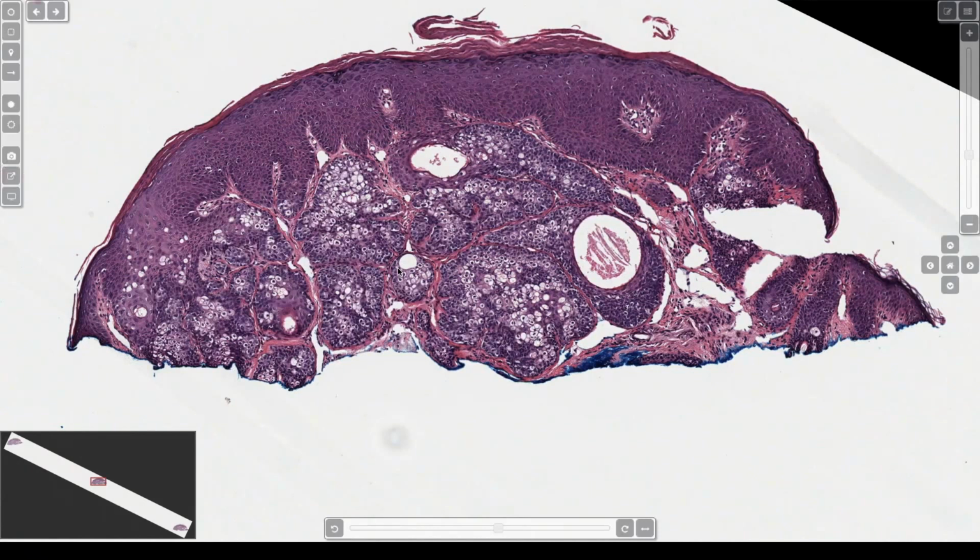And if I have one that's a little funny looking and it's shaved across the bottom and transected, sometimes I'll say, I think it's a sebaceous adenoma, but it's got some atypia. Please do an excision just so I can see the whole thing. Because I did have one once that I thought was sebaceous adenoma and it recurred and it was actually a carcinoma, but on a superficial shave didn't look atypical at all. So I don't routinely recommend these be re-excised, but if I have something concerning and it's broadly transected, again, it's one of those things that doesn't happen that often and I would rather just have them go and make sure that we're seeing the whole thing than miss something serious.